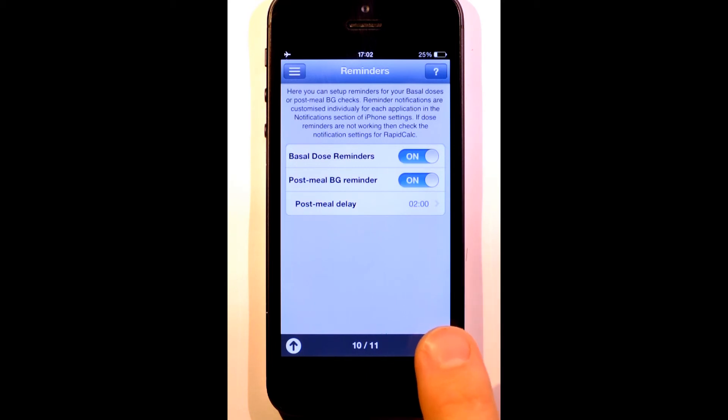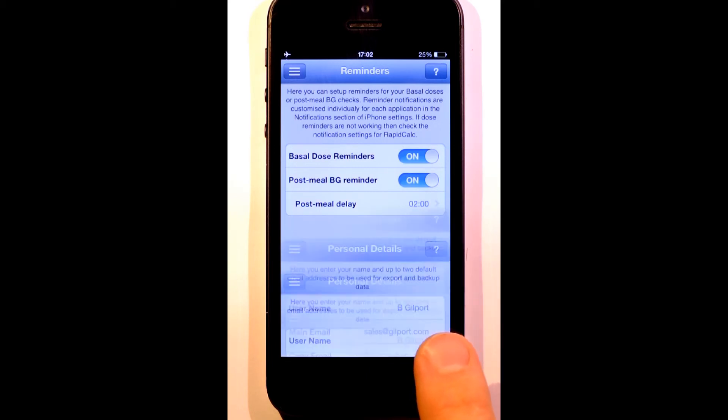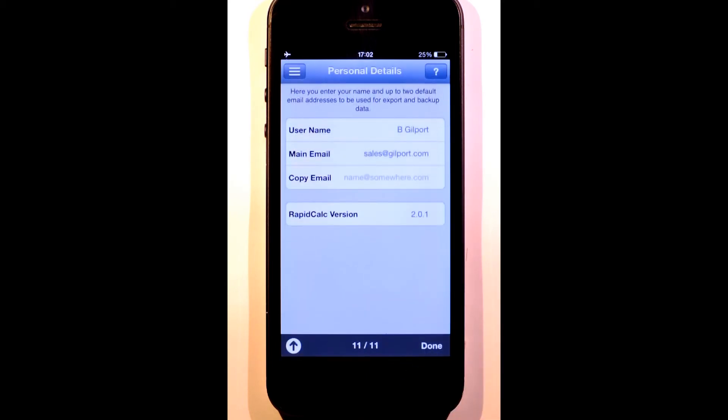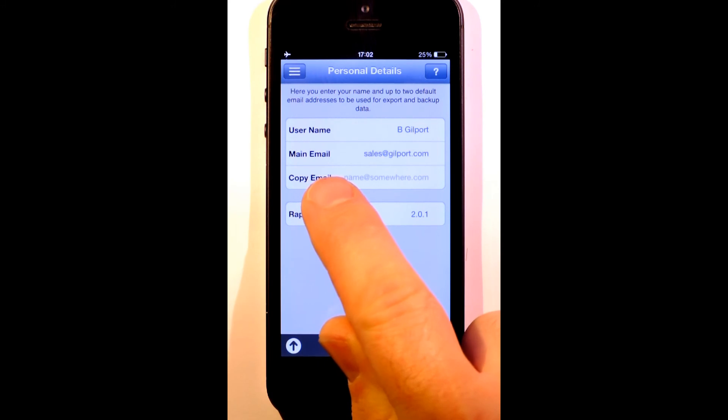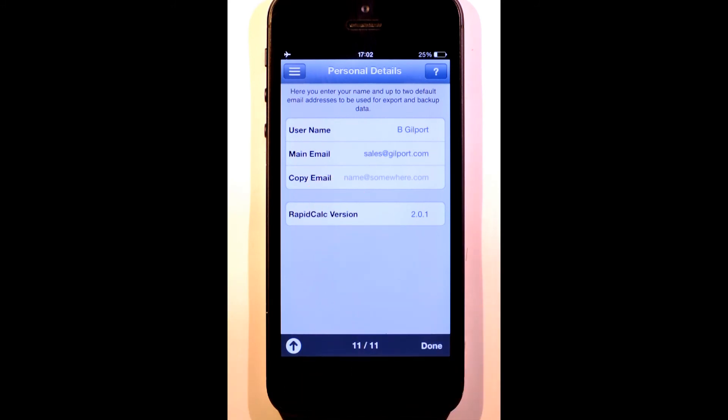Our final section contains your personal details. This information is used when you backup or export your data. The copy email address is useful if you want to share a copy of your data with your healthcare professional. Obviously, it's up to you who you share your information with. None of your data is sent or used for any other purpose.